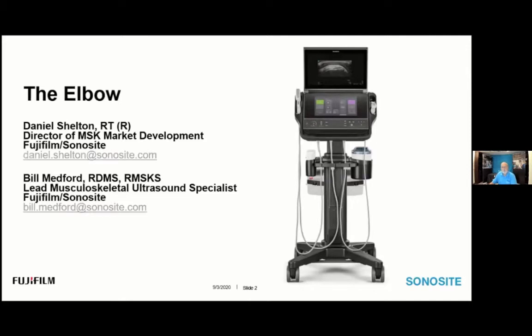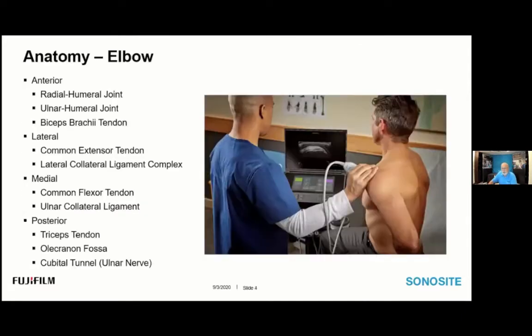Bill Medford is the lead MSK specialist with over 40 years of experience as a sonographer and 22 years of that experience in MSK. This slide shows an outline of what we will cover today, and Bill will begin with a review of the role of ultrasound in elbow examinations.